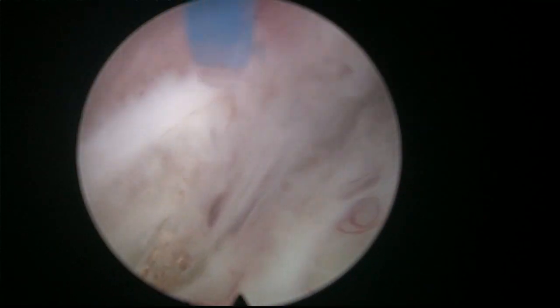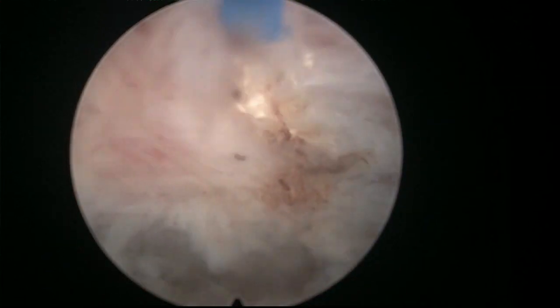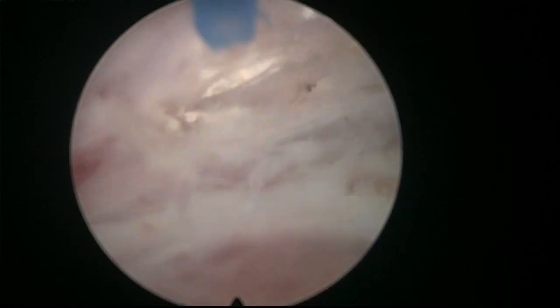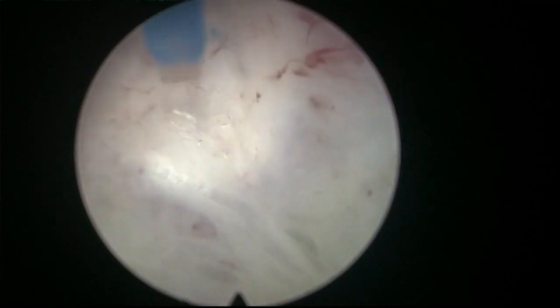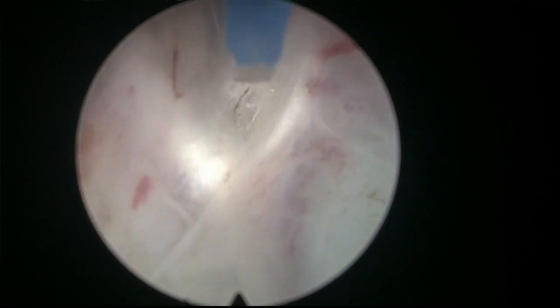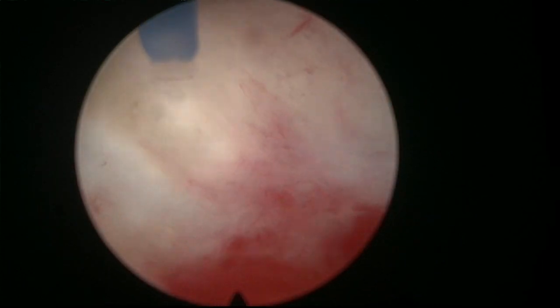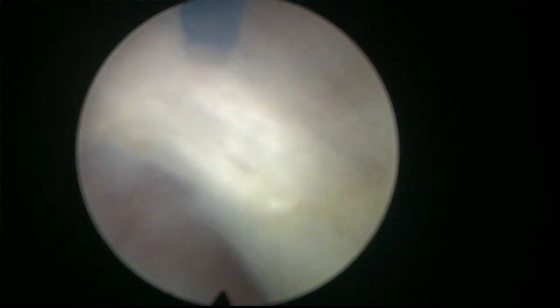So it's important to, let's say, carry a good hemostasis as you go and recheck it, because many times there is some degree of spasm of the vessels when you cut through them. Initially they don't bleed, but then they start bleeding a little bit. So, of course, we don't want to go too slow, generating very exaggerated hemostasis and widening of the whole fossa, it's not usually necessary. So you have to try to find the right balance for you, of speed of dissection and quality of hemostasis.